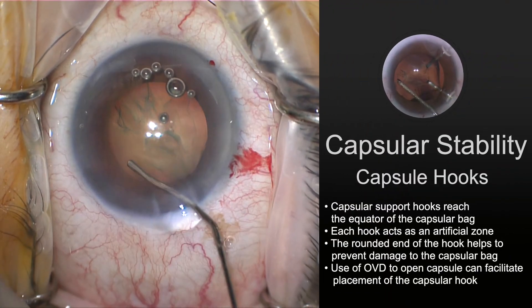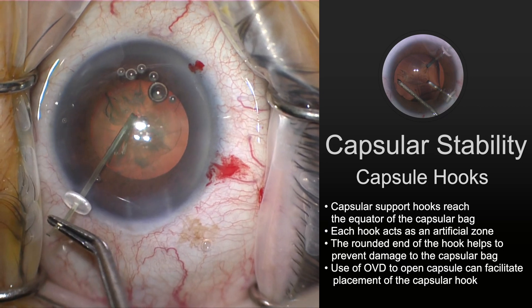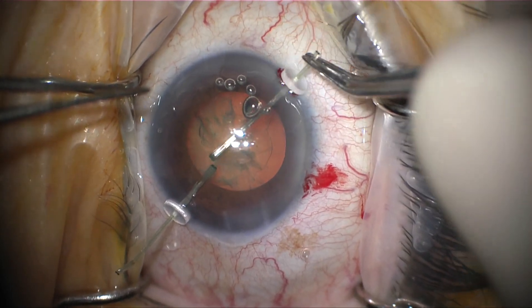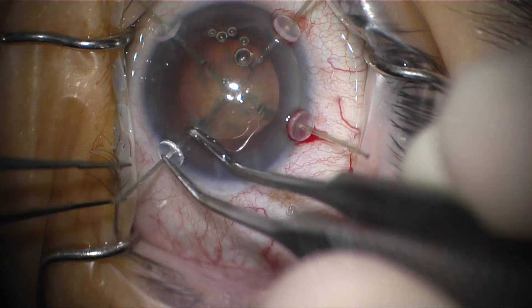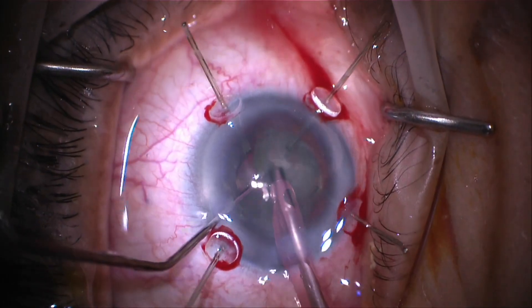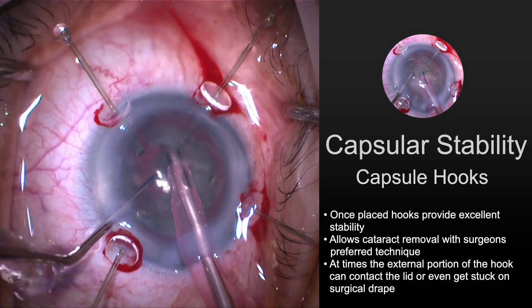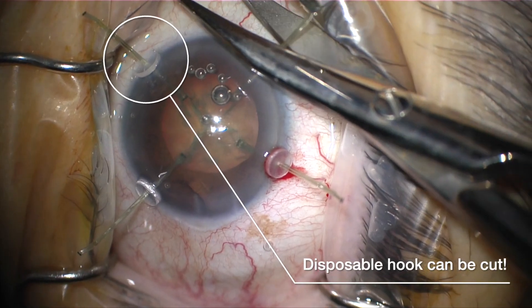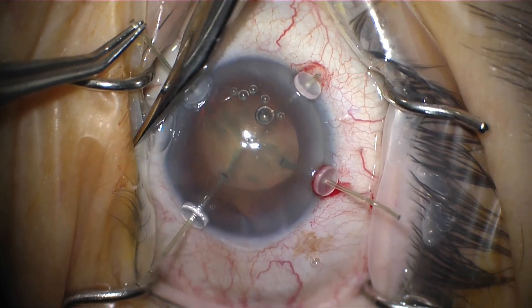Some tips to get these capsular hooks in place: after or even before you've completed your capsulorhexis, place a little OVD underneath the anterior rhexis — that's going to make a little space for these hooks to be placed. Depending on the level of zonular instability, you may need one, two, three, or even four of these hooks. Don't tighten the hooks all the way down until all three or four of them are placed. Then carefully balance the tension of the hook. These will really hold things in place well, allowing you to do your standard cataract surgery. But look here — those little legs sticking out of the eye will bump against the lid speculum; they can stick on the drape and actually cause damage inside the eye. So these are disposable capsule hooks and you can cut them. By cutting the edges off, you take them away from the edge of the drape and the lid speculum, allowing a little more mobility.